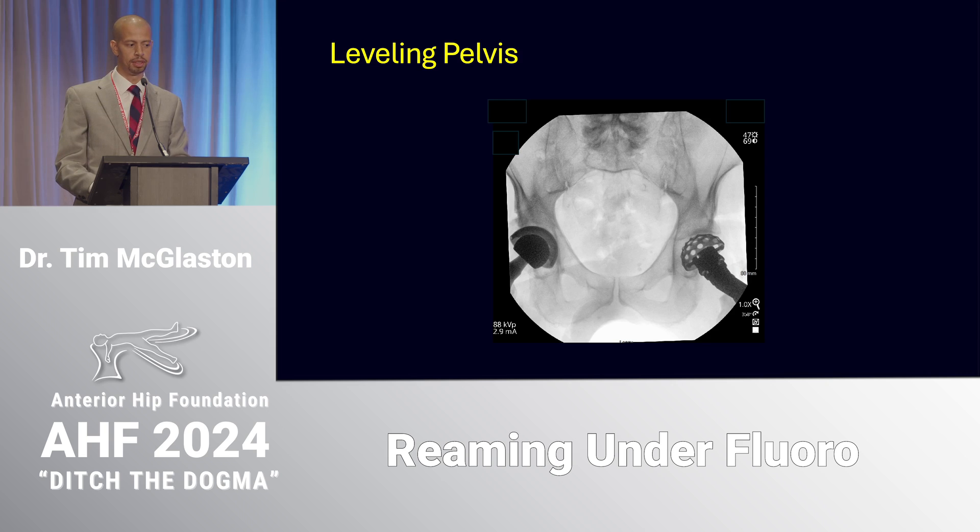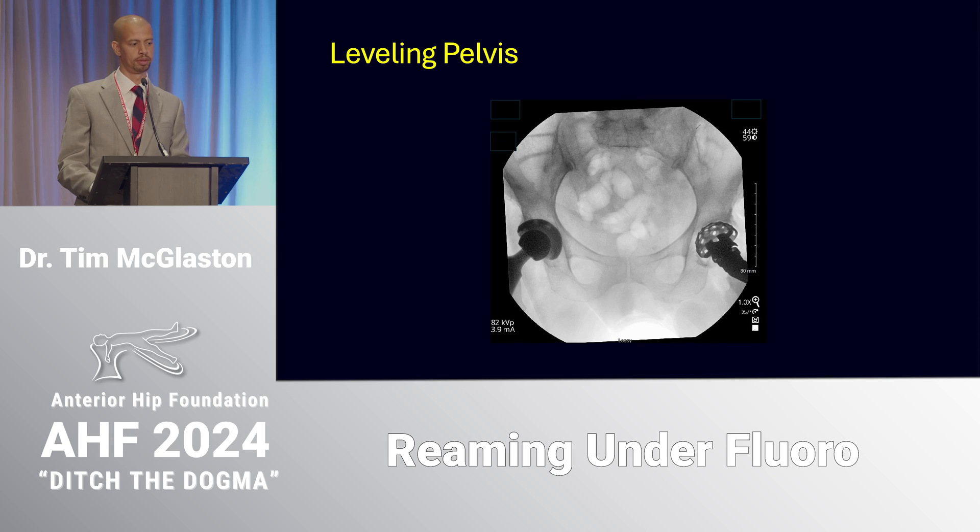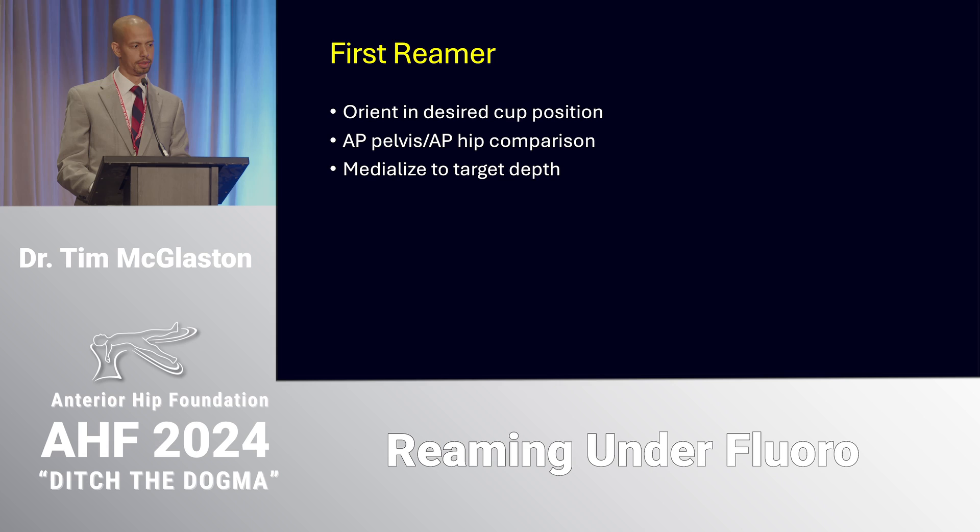Now we have a symmetric relationship between the ilio-ischial line and the teardrop, and the pubic symphysis is midline with the sacrum. In instances where there's previous pelvic ring trauma or asymmetry, I rely more on the relationship between the ilio-ischial line and the teardrop than on the symphysis-to-sacrum relationship. Here's another example: the ilio-ischial line on the patient's left bisects the teardrop, it's a bit lateral on the right, and the pubic symphysis is rotated toward the patient's left — airplane the table right and everything lines up.